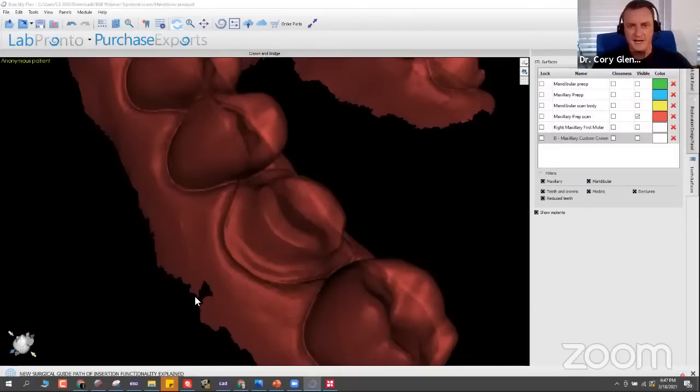Do you buy a selection of shades and can color be modified by staining? You can definitely stain it. And they do have five or six shades of this. You know, posterior crowns, I'd probably be the guy that had A2 for everyone. But yeah, there are multiple shades. And again, they're big upfront expenses, but you don't have to buy a liter. You can buy a half a liter. And you also get a lot of crowns out of that resin. So that's not as painful.